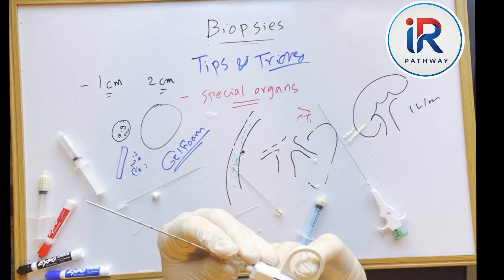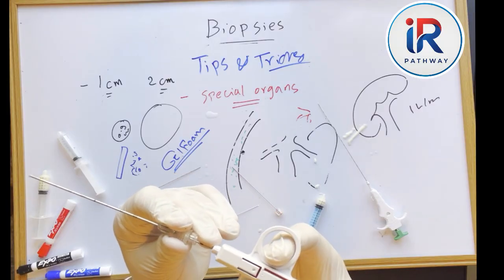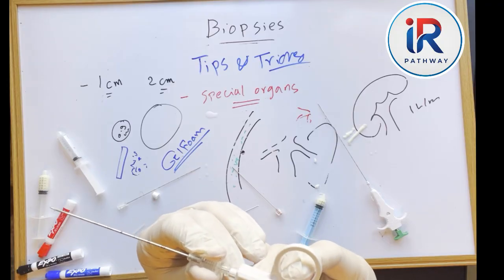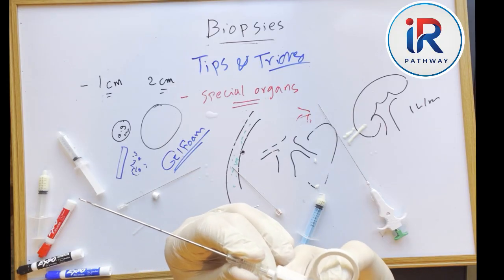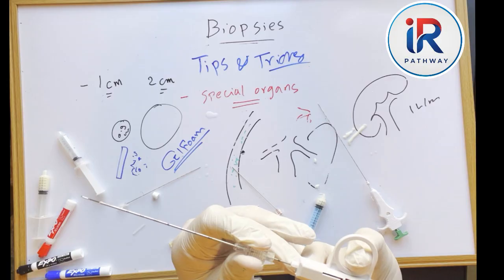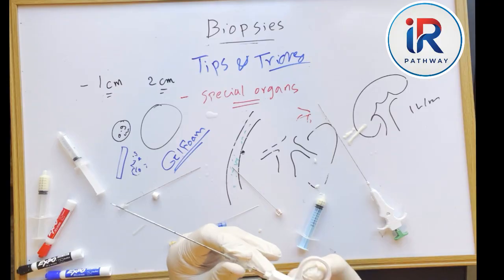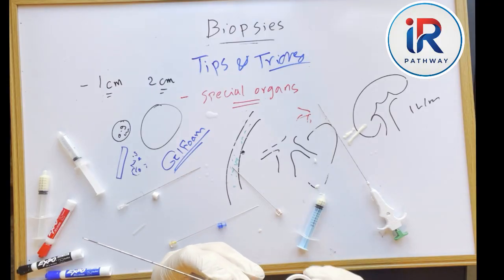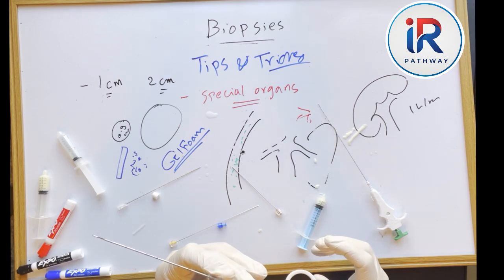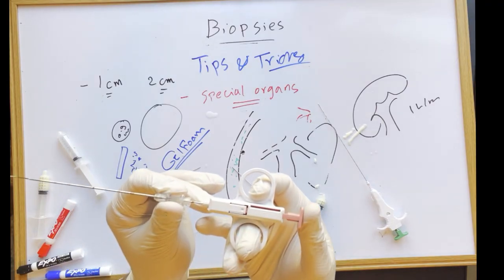As you have noticed, this technique requires a certain level of experience. You need to maintain the 1 centimeter distance, and the problem is that while advancing the needle, you may accidentally lose this distance. Once that happens, you have switched to a 2 centimeter biopsy, and that won't help if you want to obtain a 1 centimeter sample. That's why I always say it's better to use the dedicated devices whenever possible. If you want to try this maneuver, practice it first in a superficial or low-risk case. And always keep your eye on that 1 centimeter. Don't lose it during needle manipulation.